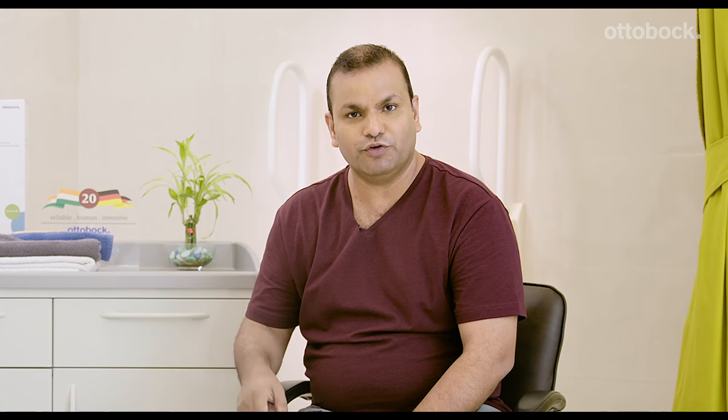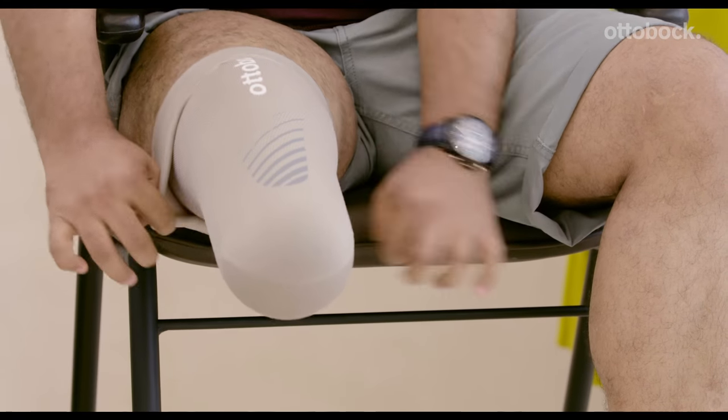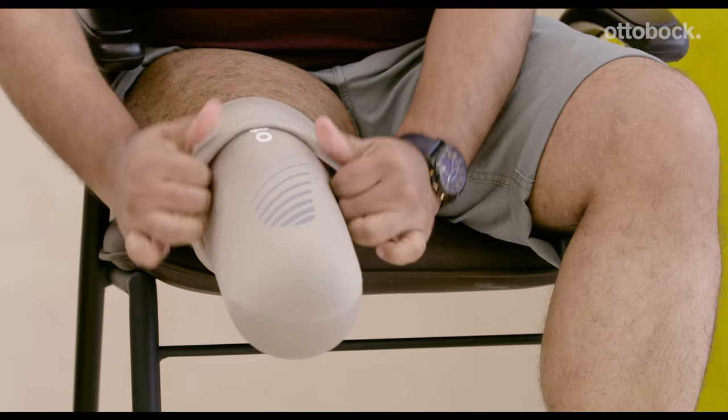Similarly, to take off your liner, gently roll over the upper edge of your liner and pull it down so that it slides out again.